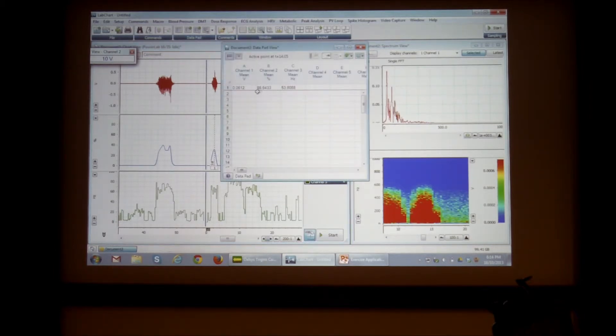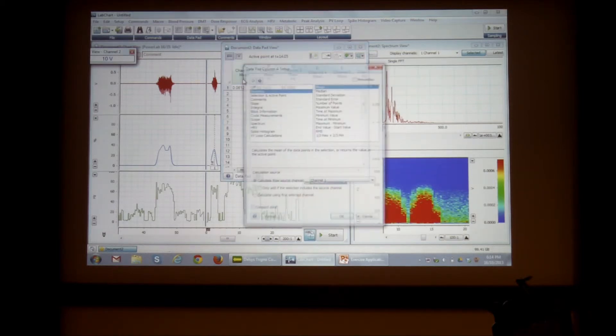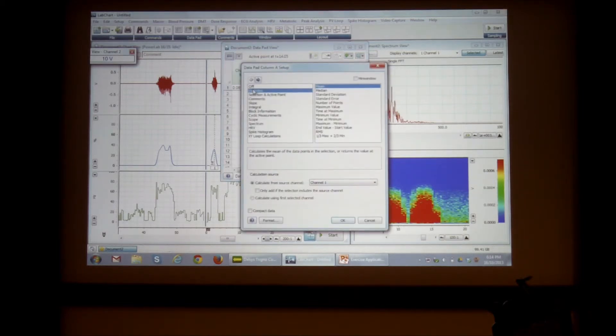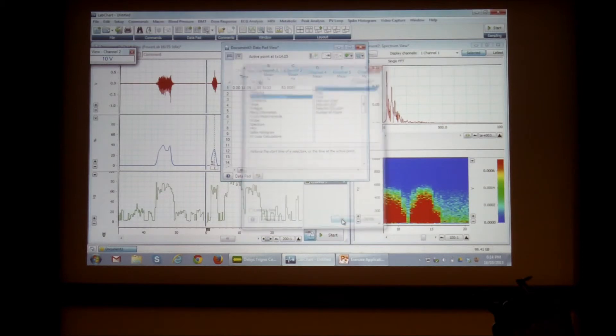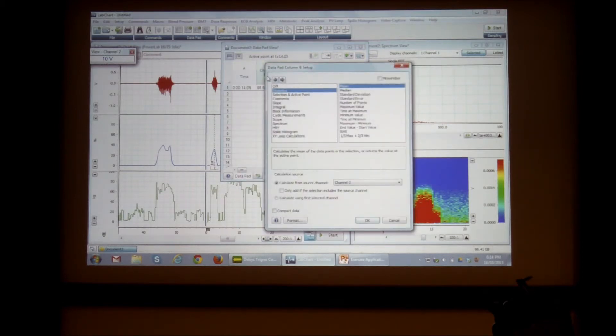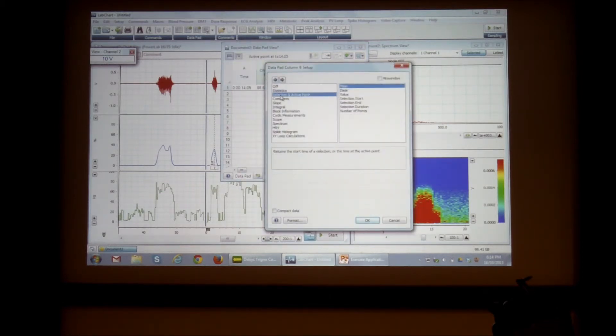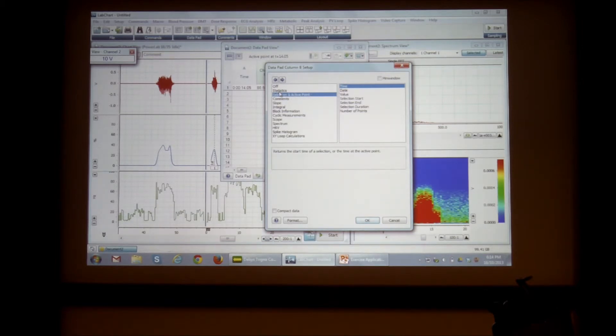But before I add it, I'm just going to set up a few columns. I want to have this as the type. I want to have this one as the actual, I'll say the mean value.